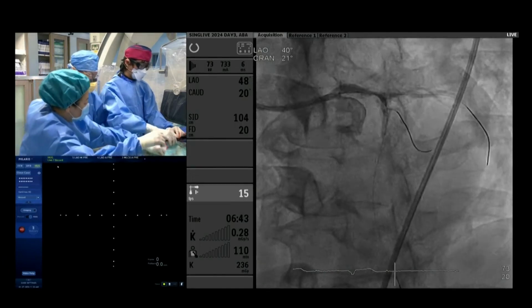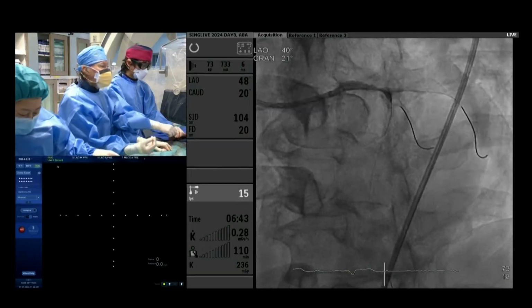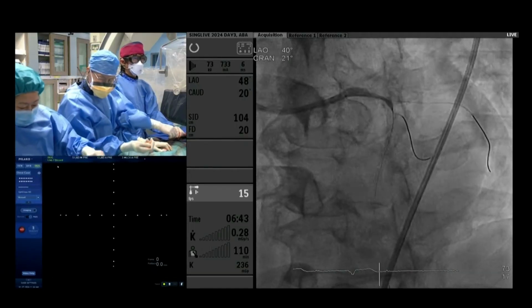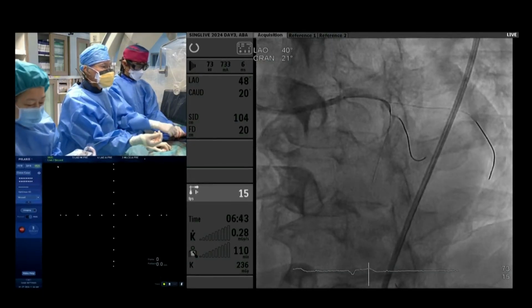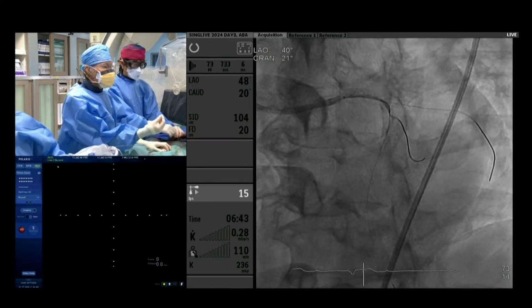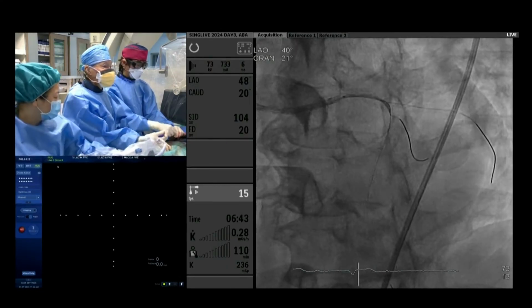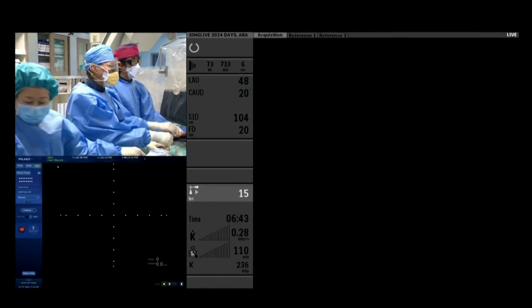We just thought we would quickly put in the IVUS and make sure everything seems quite all right. And then next up, we are going to start dilating the 2 newly implanted stents. It's a good tip that we should port it. But because we got 3 wires there, I think we need to at least remove 1 wire.